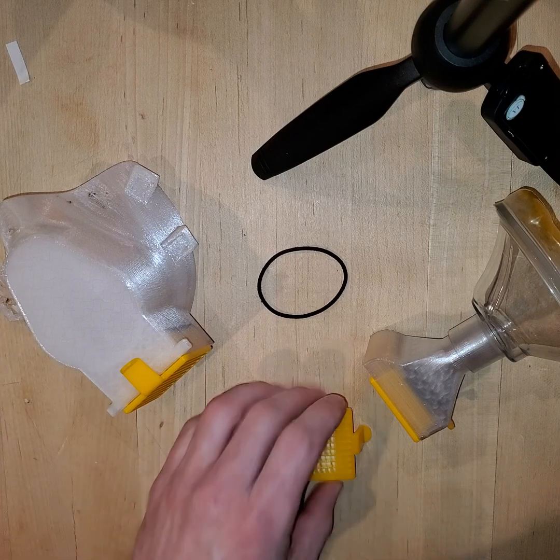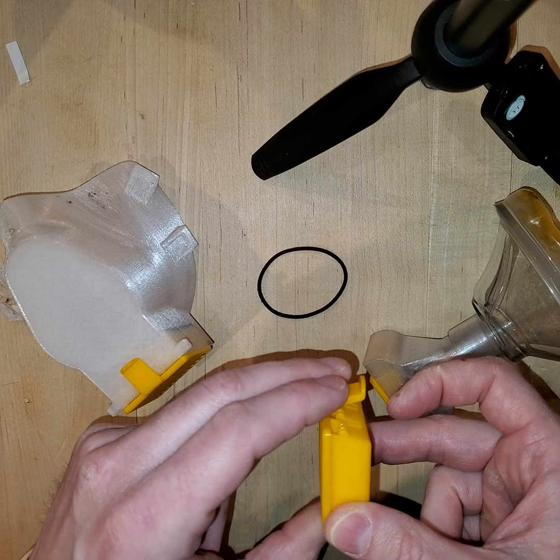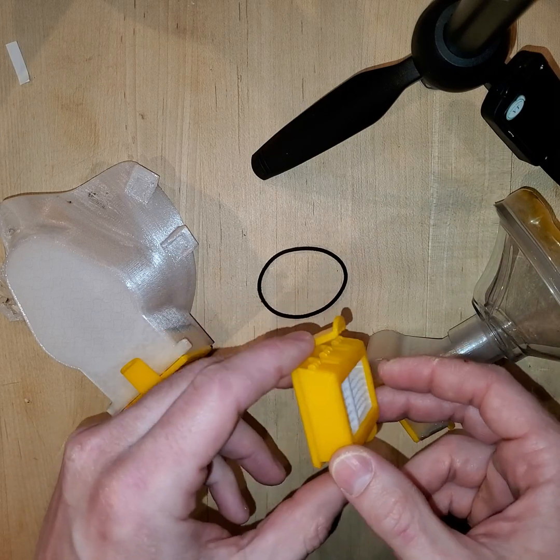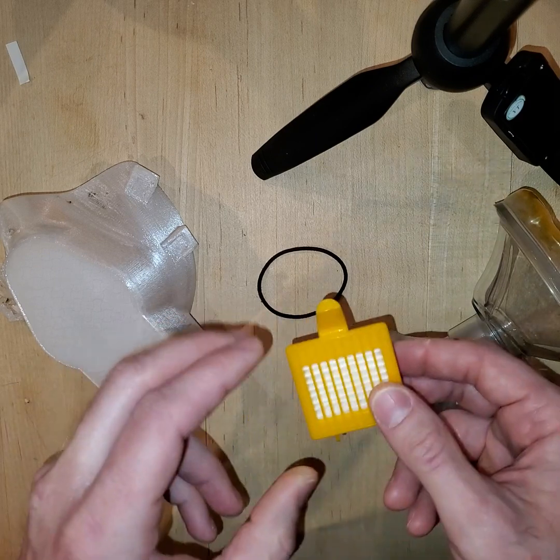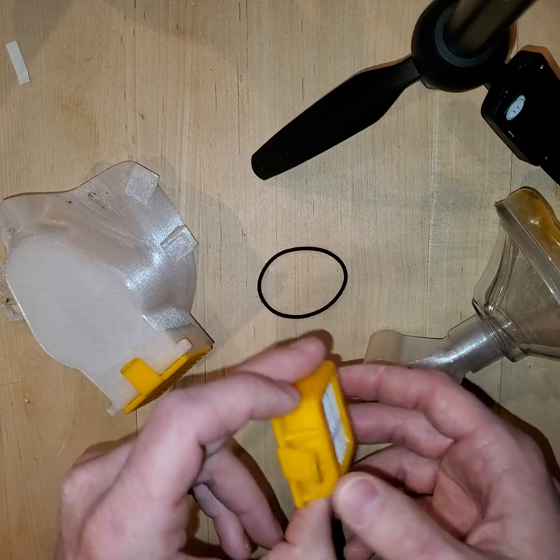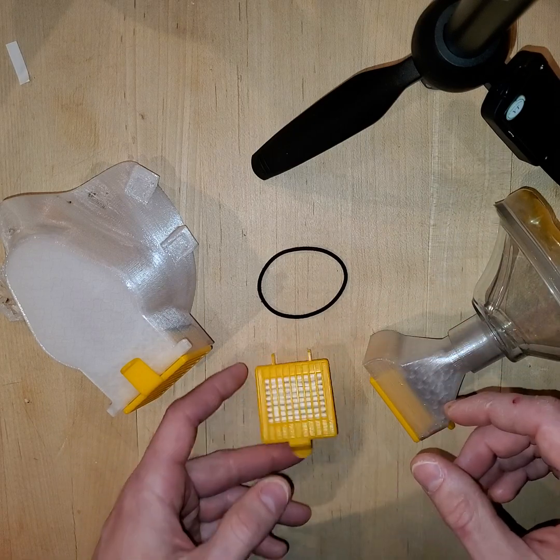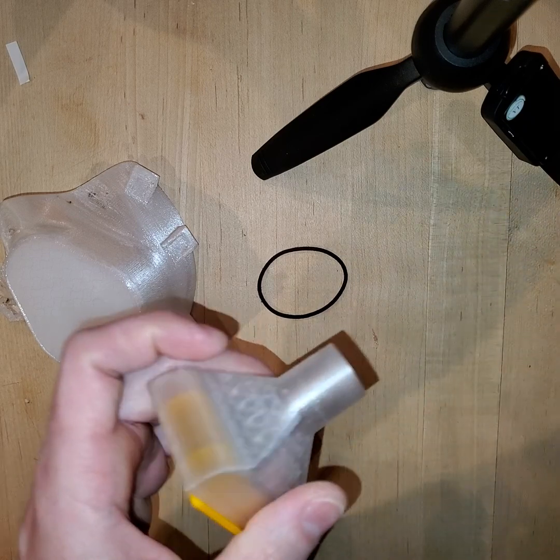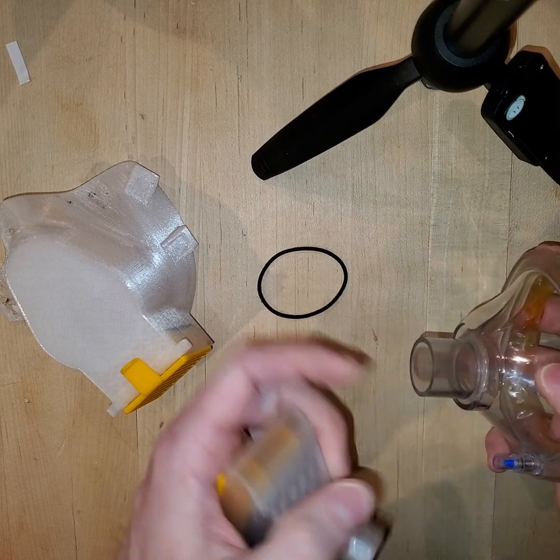So first of all, this is a Roomba, a robot vacuum cleaner for the house. It's super small, and I've seen a couple other people talk about using it for a mask filter. The first person I saw to actually use it in the design was Wally Renee, so I took his idea and kind of ran with it a little bit. First of all, super simple. This is just an adapter to connect to a 22 millimeter port.